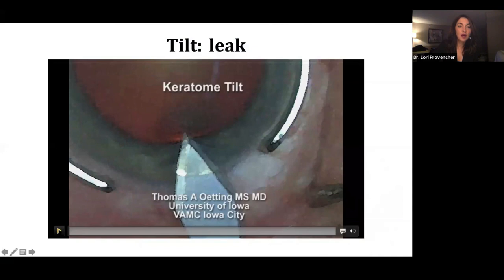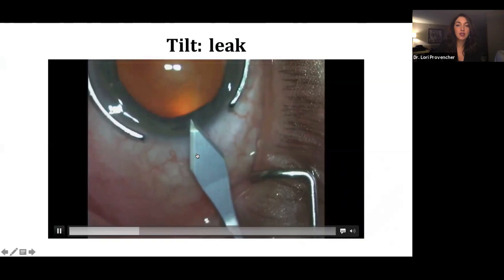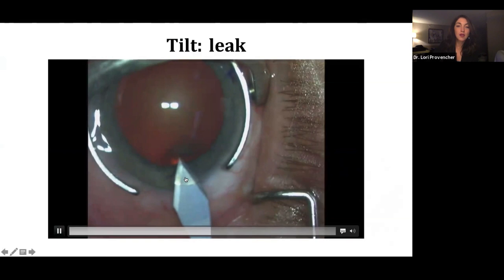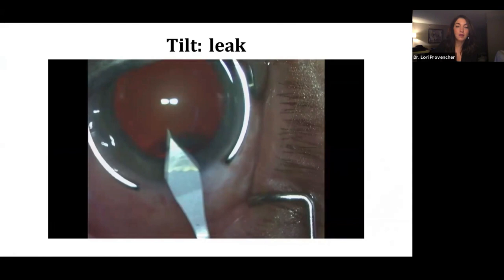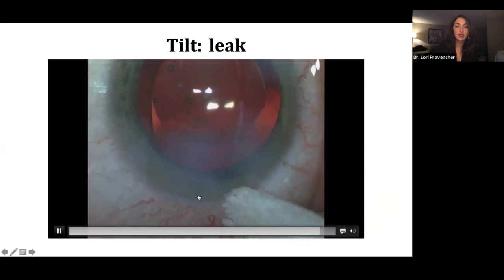And then here's a common problem, and I really learned how to avoid this when I was assisting and watching other people doing their wounds. You'll see that the surgeon's hand is tilted just enough so that the wound is asymmetric here. A right-handed surgeon's naturally going to supinate and tilt to the right, the opposite for a left-handed surgeon. But this causes the roof of the wound to be asymmetric. It can tear, and it can certainly leak at the end of the case. And so here you see the wound is leaky, and this wound is probably going to need a stitch.